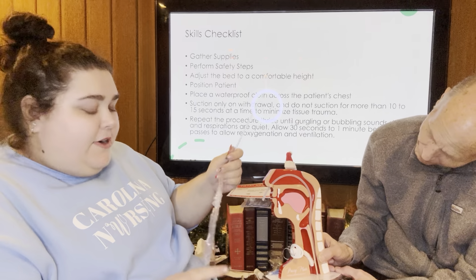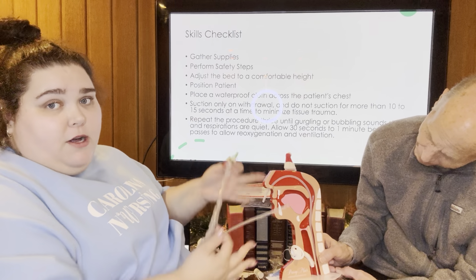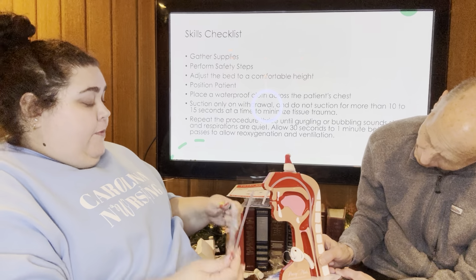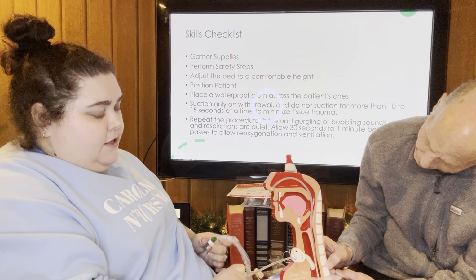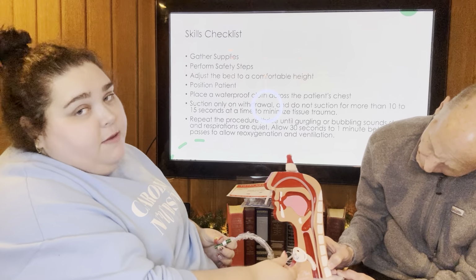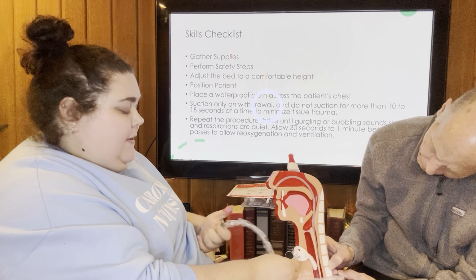He is going to be our resident shelf for right now. So in the hospital, you have all this hooked up to the wall. This is a patient that is attached to a body. We're going to take the suction tubing. This is our desired length. We're going to feed it through and down. The base of tracheostomy Tom is keeping me from going any further, but I would go a little bit further in reality.